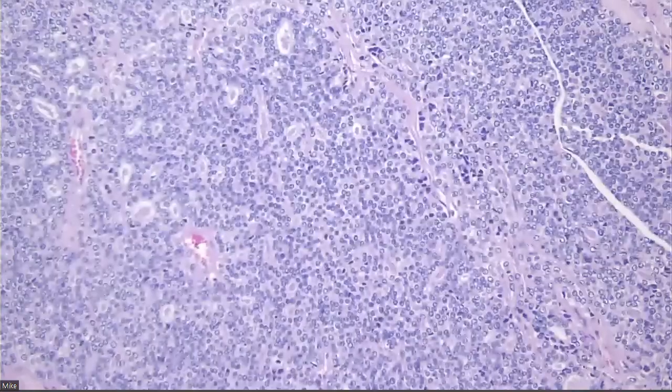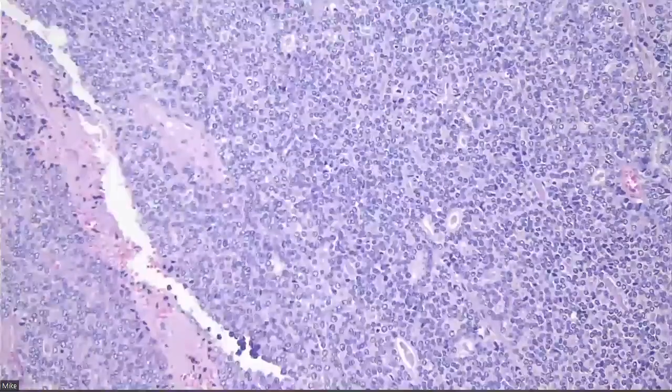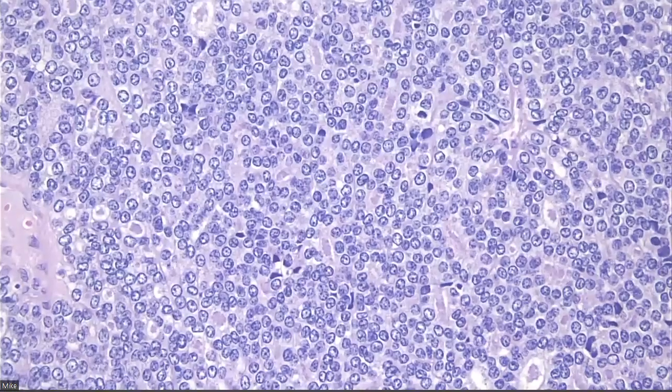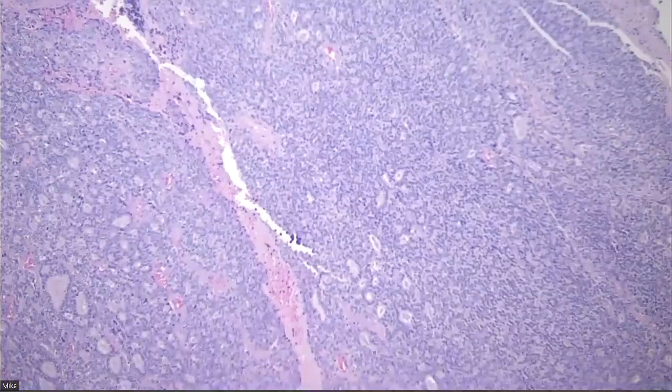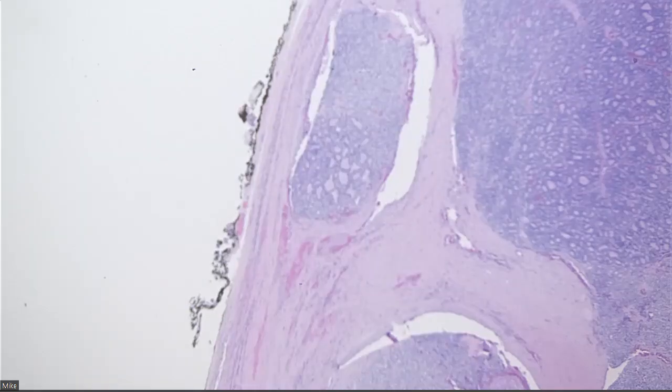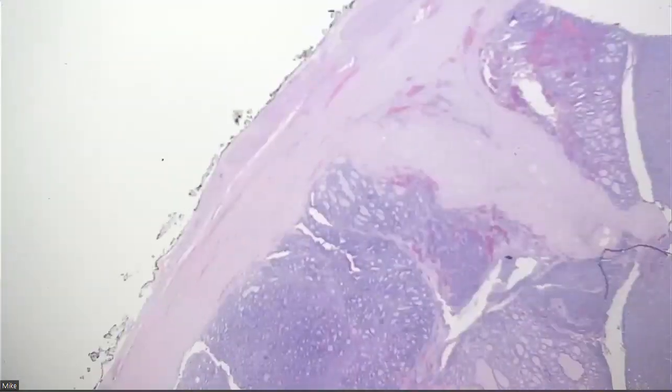And the nuclei are round and focally cleared, but they're also focally stippled. So I'm not really thinking PTC in this case. The chromatin is kind of fine. I'm starting to see mitoses now. There's one in the center. Mitoses, solid growth. I'm worried, so I go put more in. And we look at the edge for invasion. See that? Maybe put in more of the capsule because we want to see if it's invasive or what.